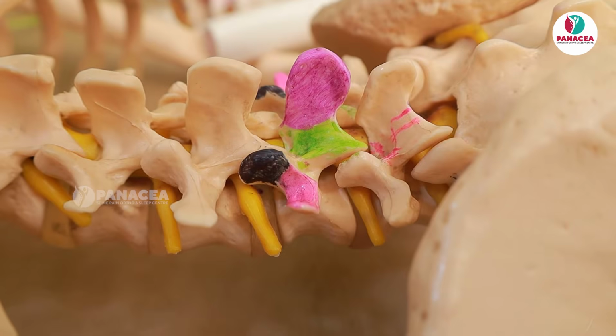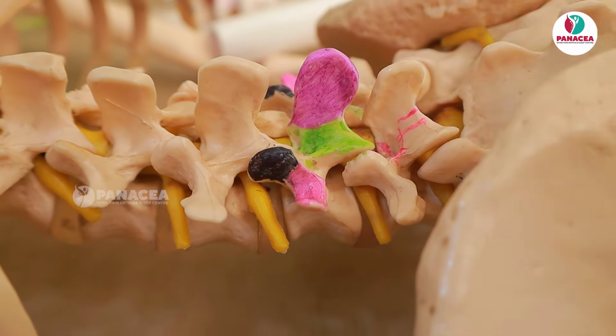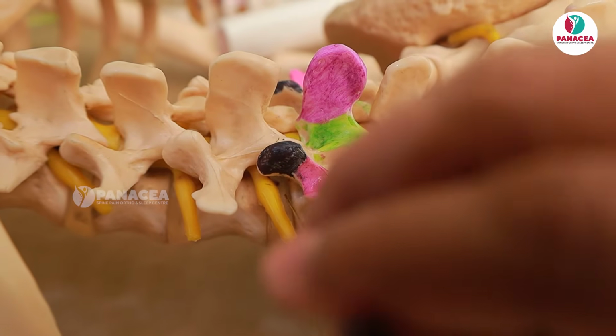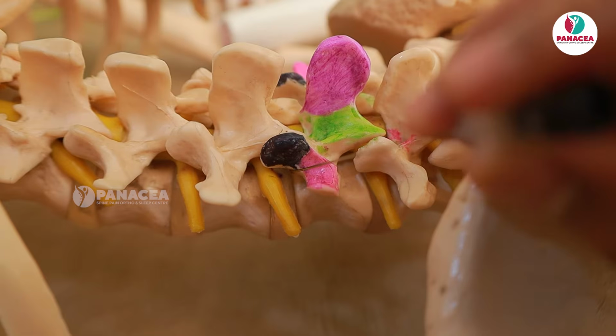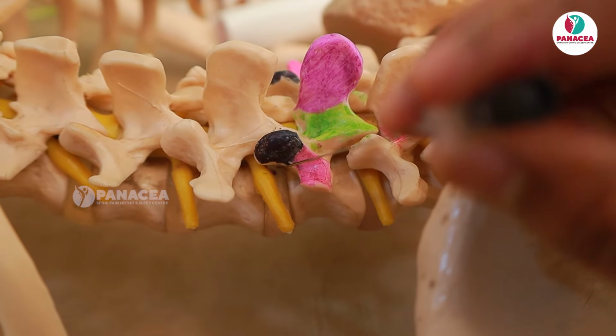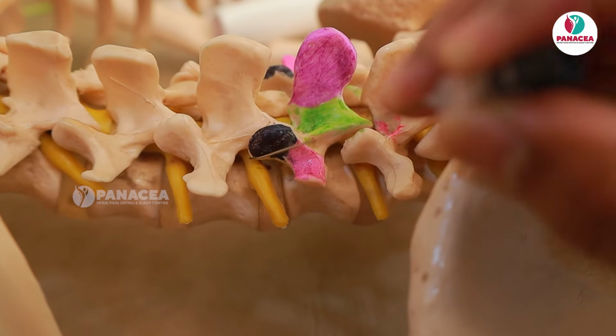Our area of interest is exactly lateral to the SAP. So we put the needle like this, and we go end-on view from here to the anterior, ventral aspect of the epidural space. See, this is the exiting nerve root.